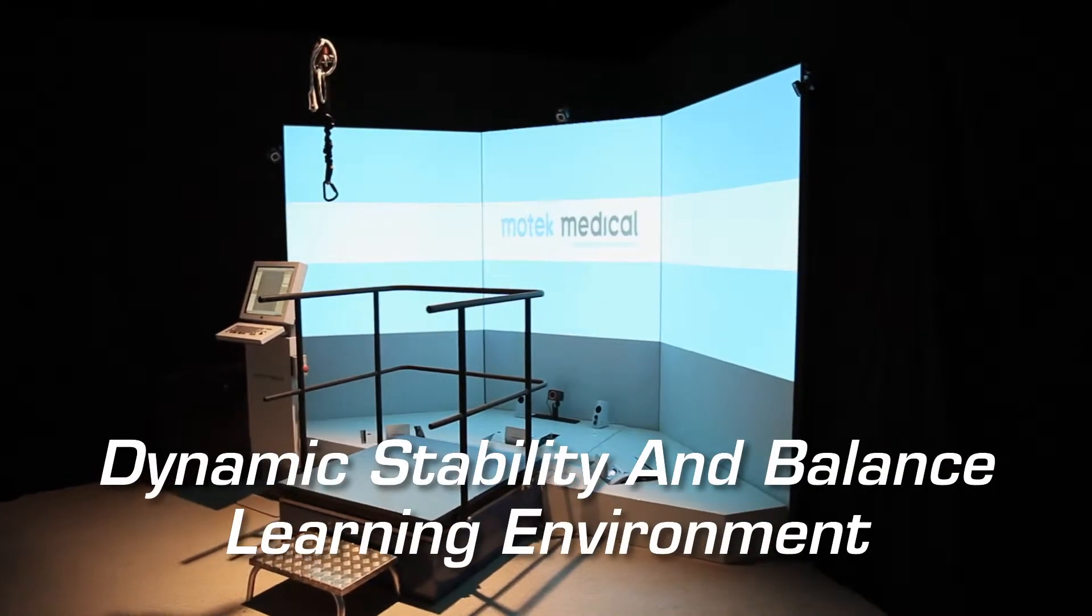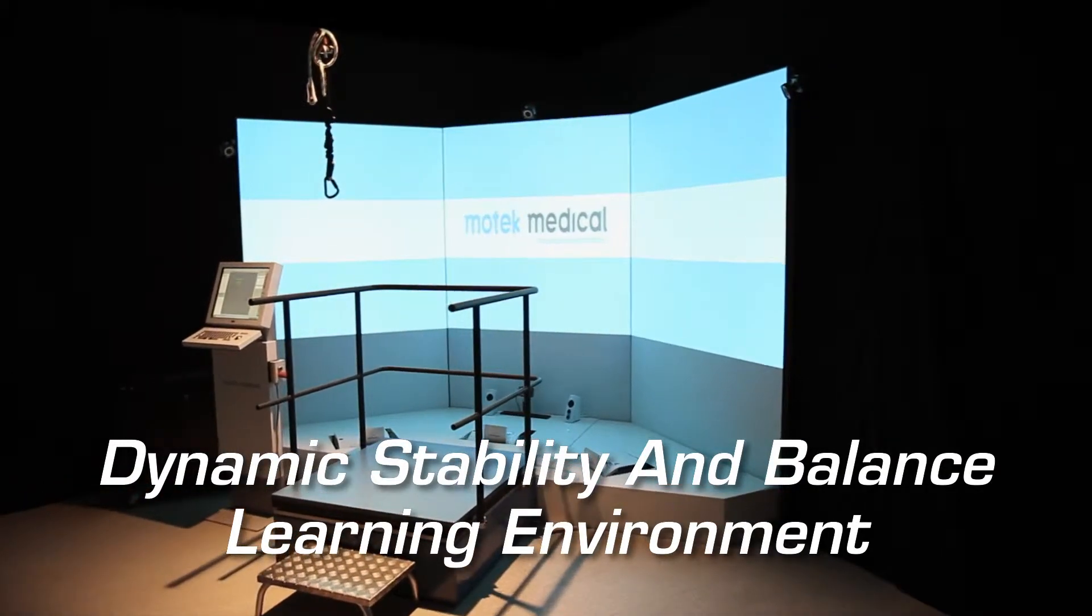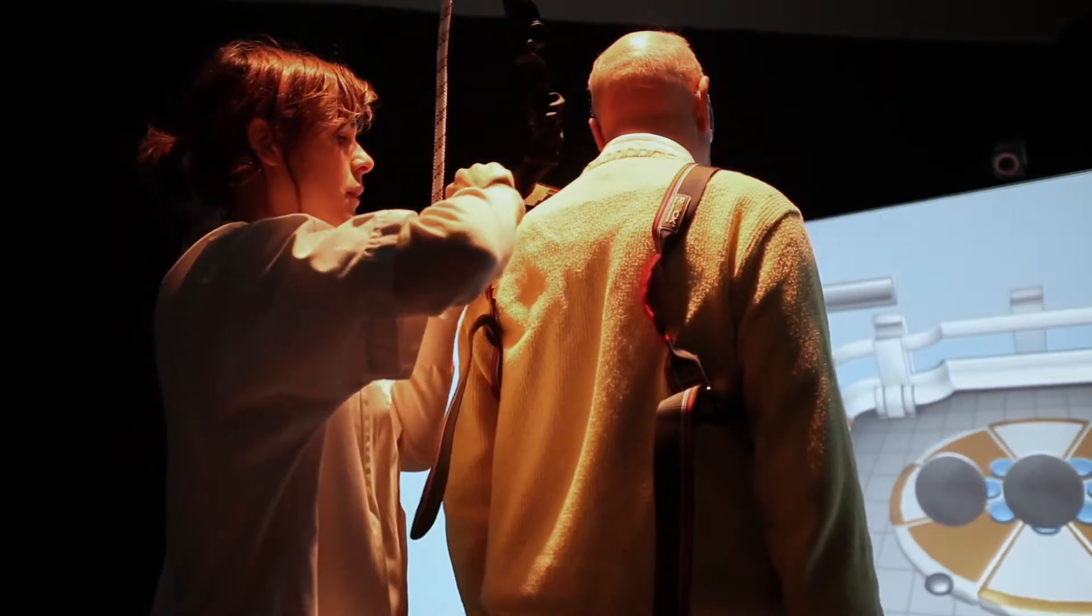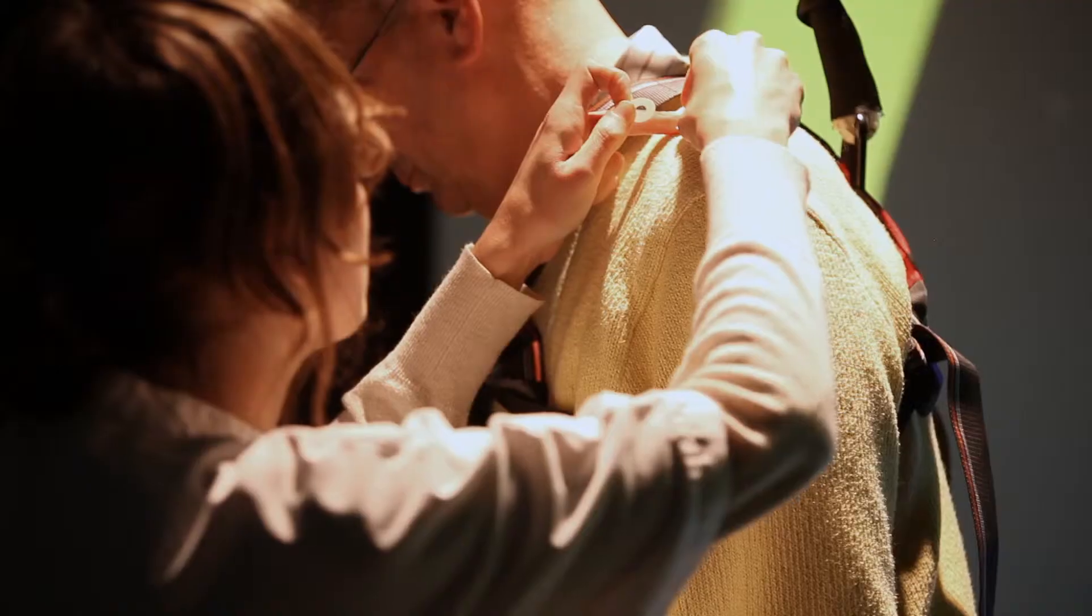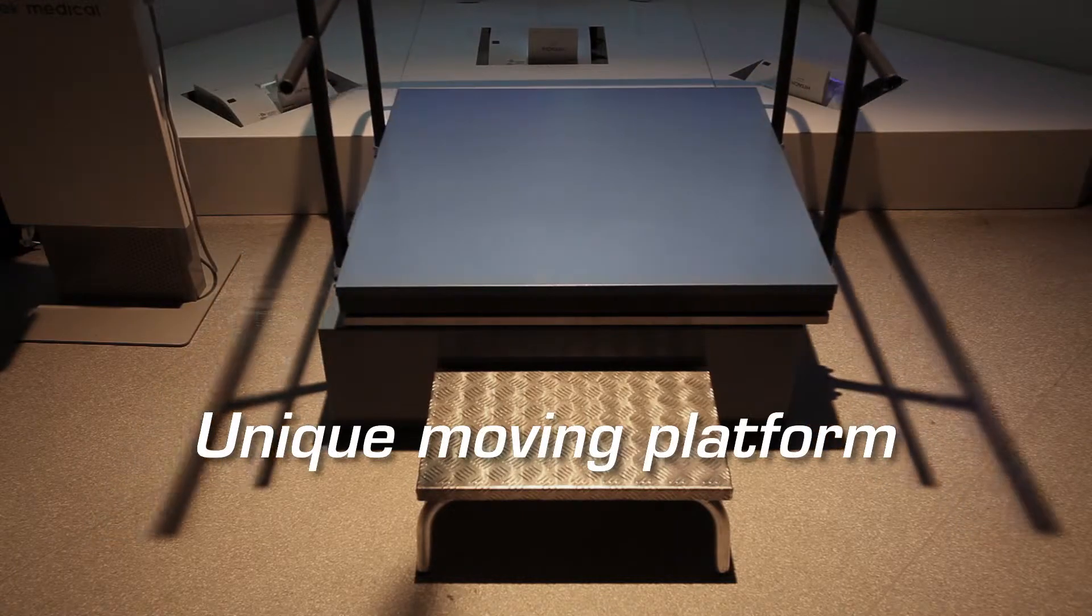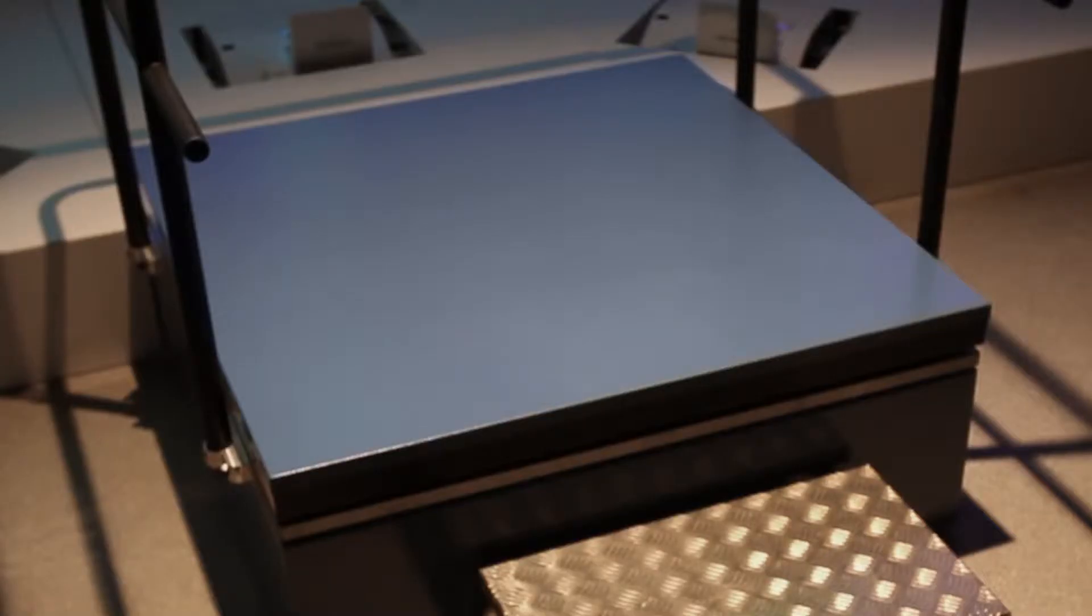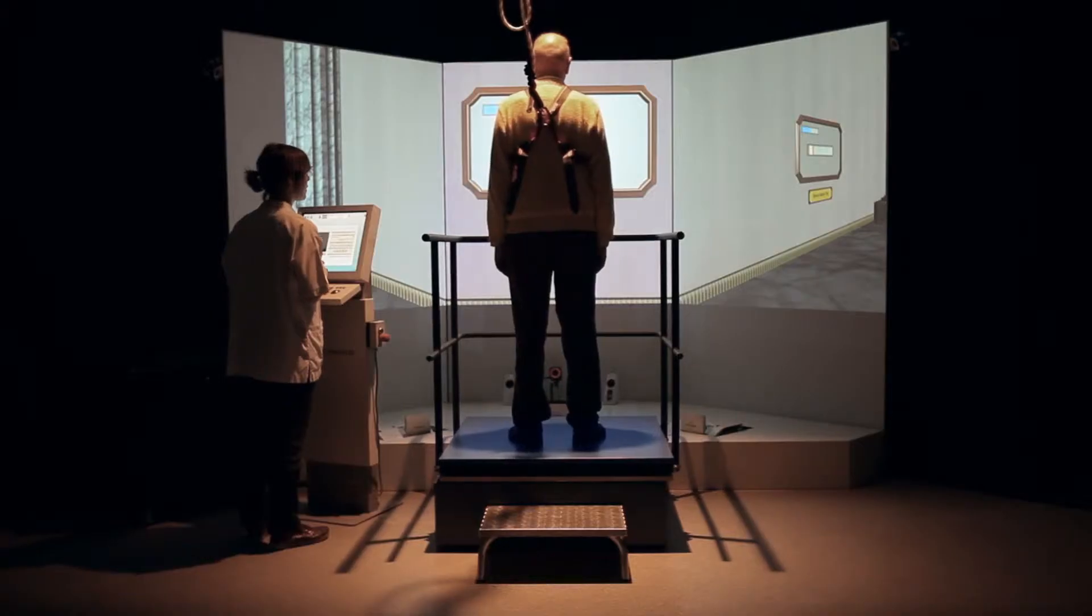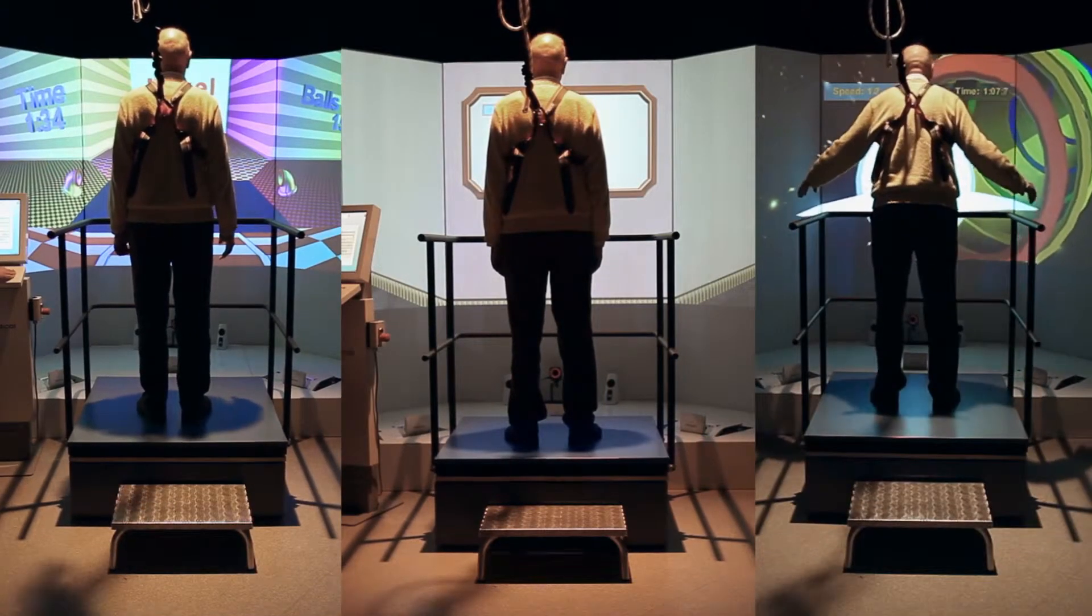Motek Medical's Dynamic Stability and Balance Learning Environment offers an integrated solution for assessment and training of every aspect of impaired stability and balance control. With a unique moving platform, motion capture techniques, a force plate and an interactive virtual reality system, the DynStable offers various therapeutic applications.